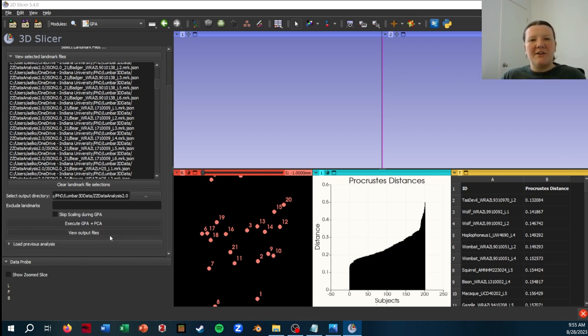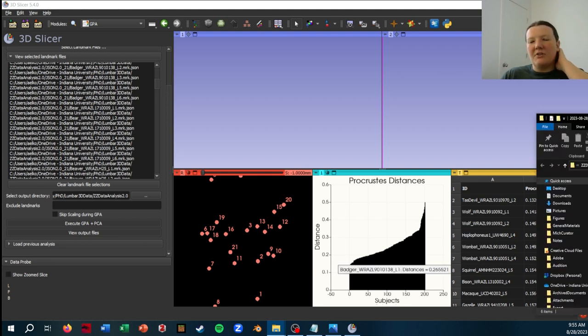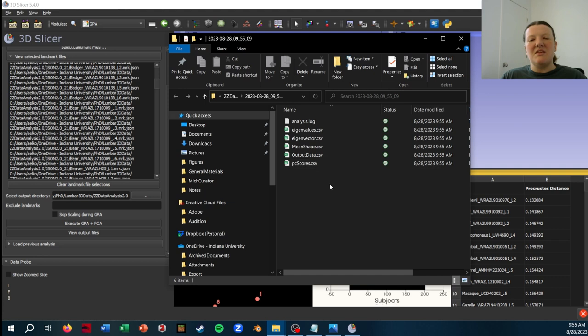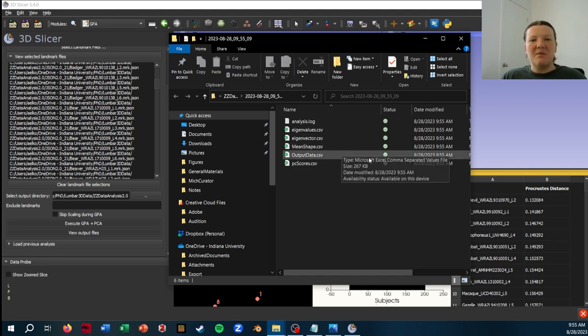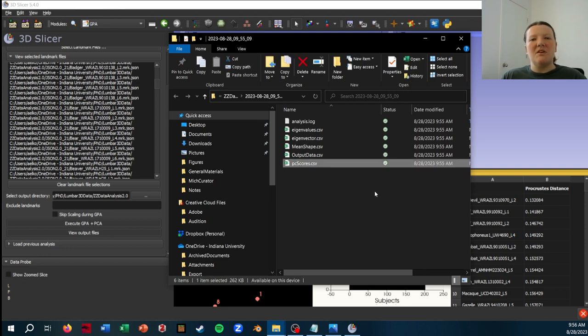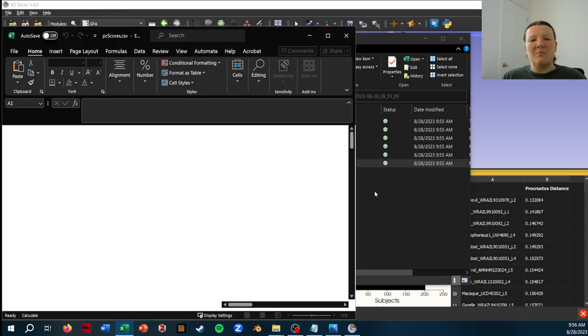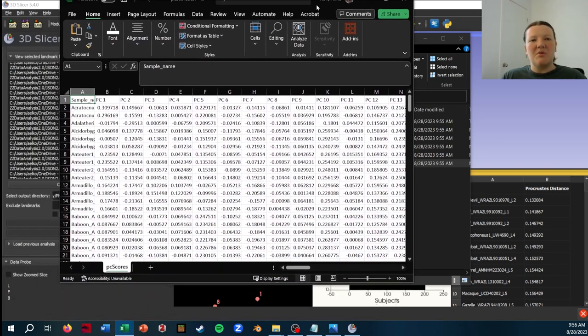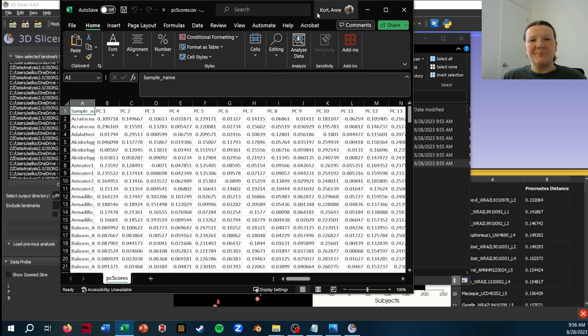You could also navigate to it in your directory and you will see these different tables that have been output. Depending on what you want, you could just directly use the PC scores, of course, as output from Slicer.